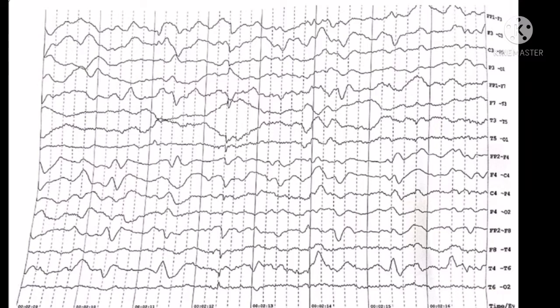Slowness may be normal like the theta slowness during drowsiness or delta slowness during sleep. However, sometimes it can be pathological.